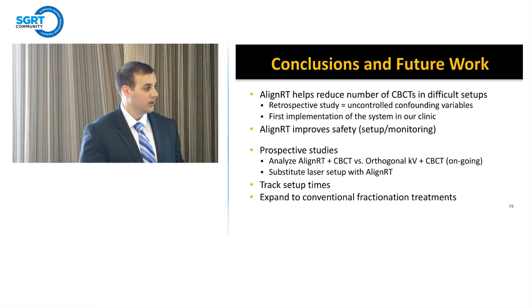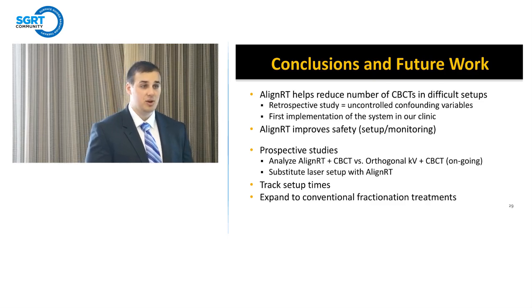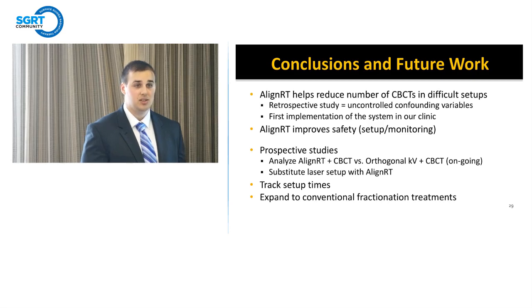dive into this. In addition, we didn't have any treatment setup times tracked, so we'd like to be able to track those actual treatment times to see the efficiency and the time metric. And then outside of SBRT, we do have conventional fractionation cases on our TrueBeam, and we'd like to compare that as well for conventional treatments.